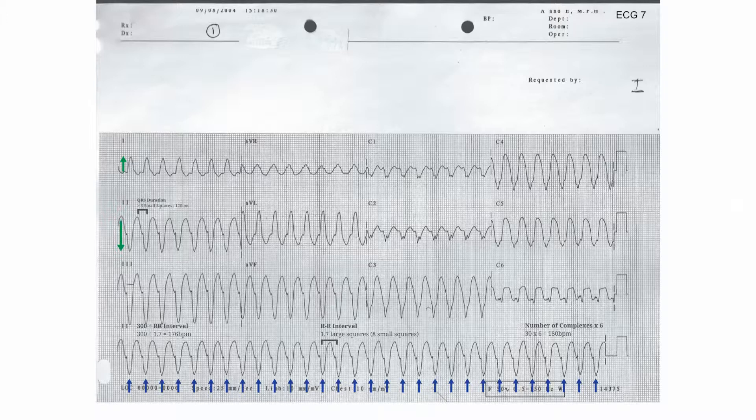Since the QRS complex is broad, it's impossible to comment on the presence or absence of pathological Q-waves, or to comment meaningfully on the ST segments or T-wave morphology.